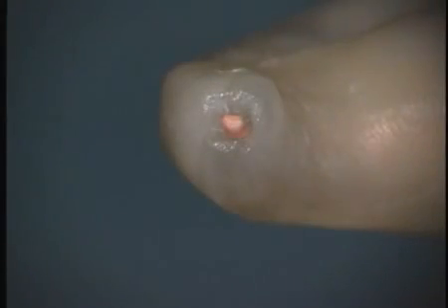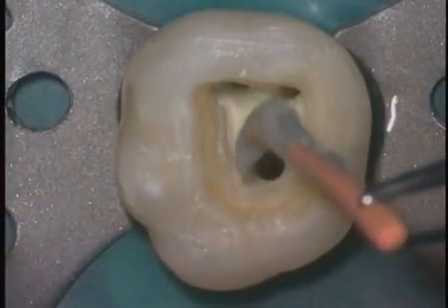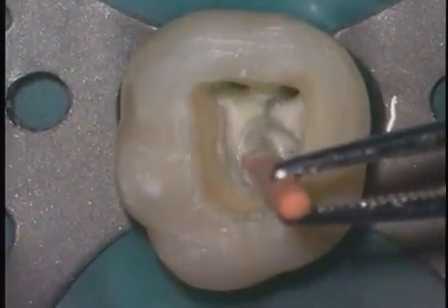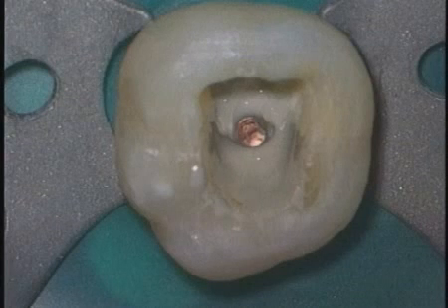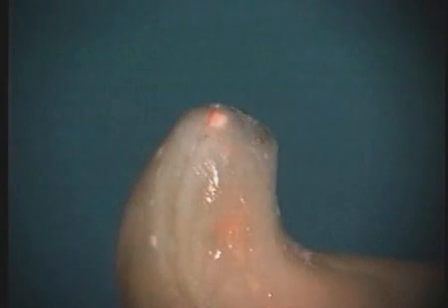Notice the discrepancy between the gutta-percha cone and the ellipticized foramen. After proper cone fit, sealer is mixed, the cone is liberally coated with sealer, and the cone is teased into place. Utilizing the warm gutta-percha with vertical condensation technique, we can carry a wave of warm rubber and sealer into the apical 1/3. Following the downpack, note the gutta-percha in this region. In this photograph, note the adaptation of the gutta-percha to the foramen and the thin film of sealer.